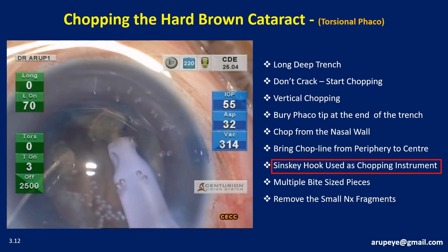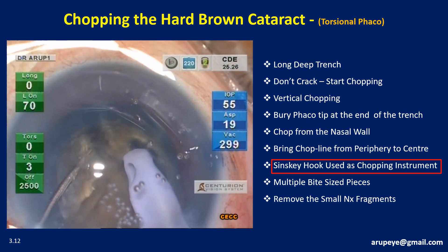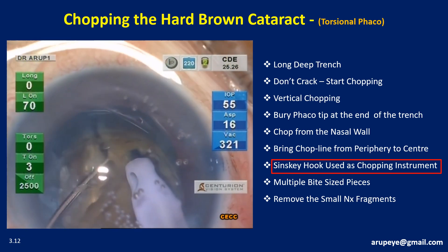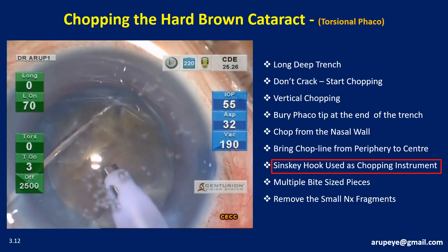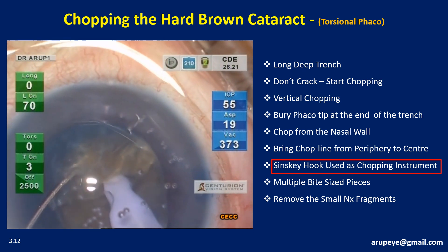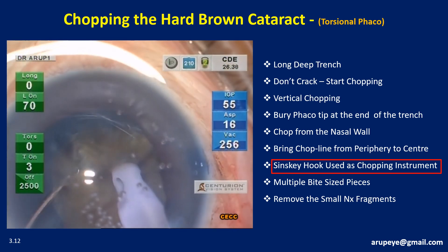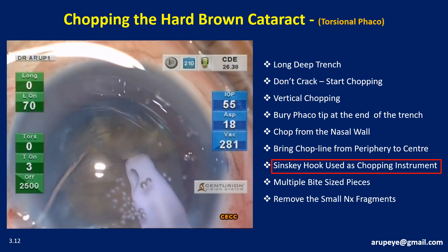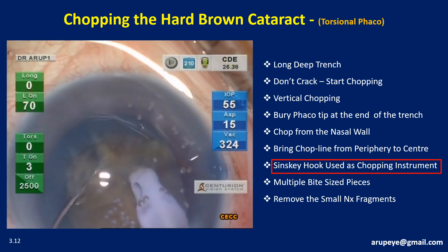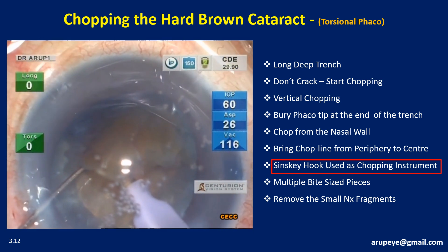The nucleus is turned 30 degrees and fresh chopping is initiated. Whenever a tendency for nucleus tilt is noticed, the phaco tip is further driven into the nucleus with an additional burst of power without withdrawing it. At the end of this stage, a little wedge of the nucleus is chiseled off from the main nuclear mass. The chopping is continued sequentially after further rotating the nucleus. Since the nucleus tended to tilt, with an additional buzz the phaco tip is driven deeper without breaking the hole so that chopping can progress at a deeper plane. Care should be taken not to distort the capsular bag or stretch the rhexis margin during chopping maneuvers.